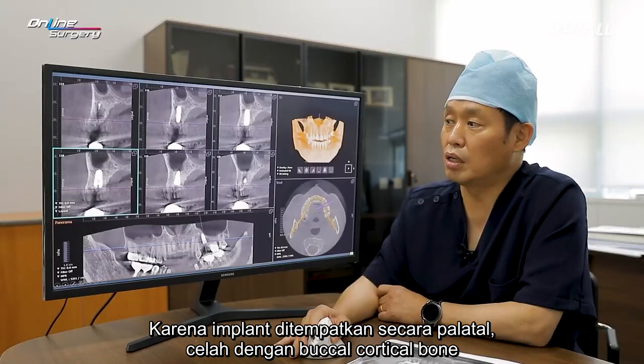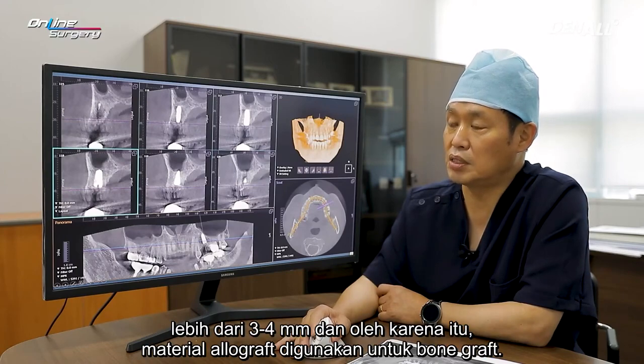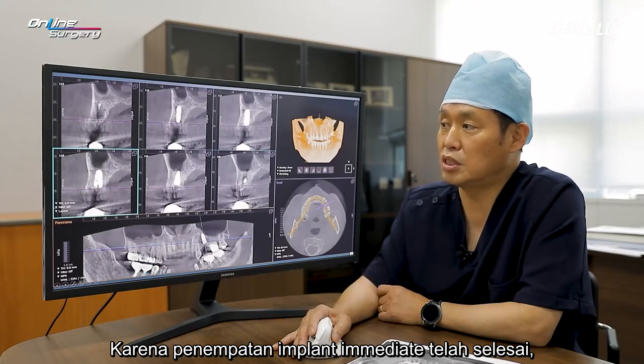Because the implant was placed palatally, the gap with the buccal cortical bone was over 3-4 millimeters and therefore allograft material was used for bone graft. Gap filling was done because immediate implant placement was done.